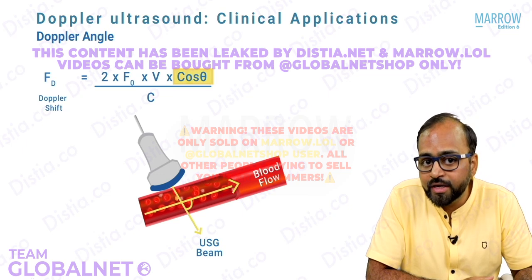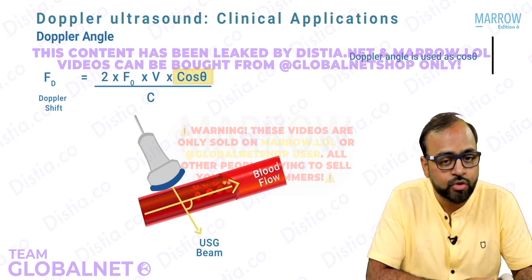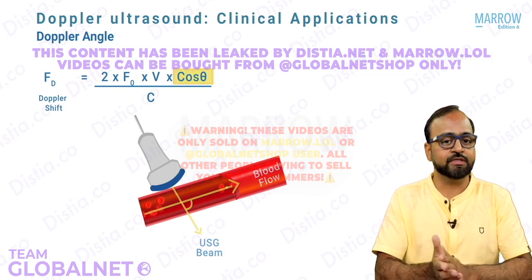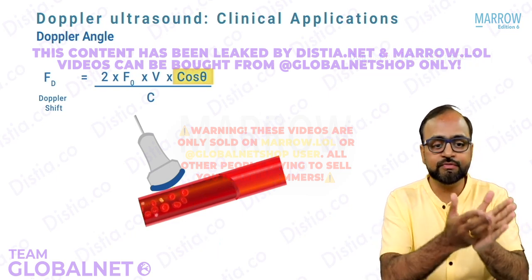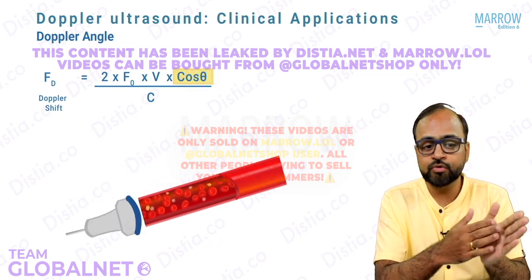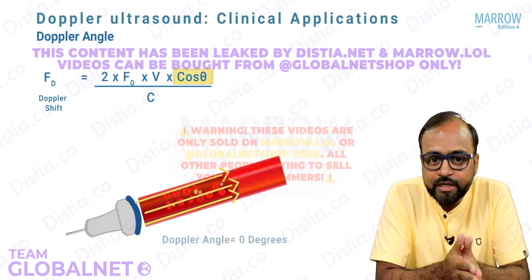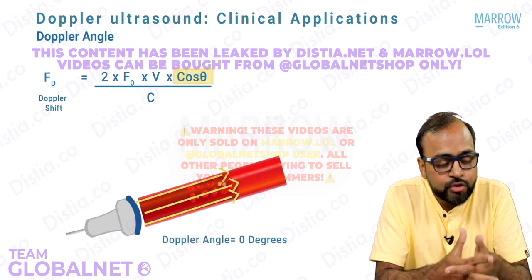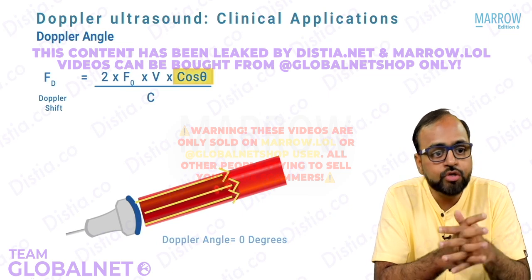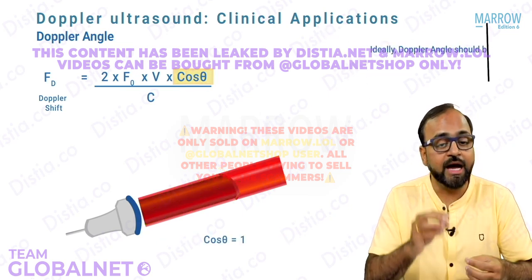Now how is the Doppler angle used in the Doppler equation? It is used as cos of its value, that is cos theta. Now look at one example. Suppose the blood is flowing in this particular direction and the probe is also angulated in this direction. So both of them are in the same plane. What is the angle between the ultrasound beam and plane of blood flow? It is 0. So theta is 0, cos of 0 is going to be 1. So this is the ideal value.